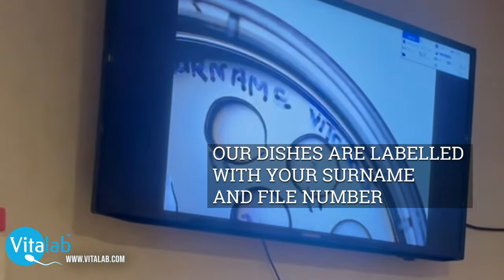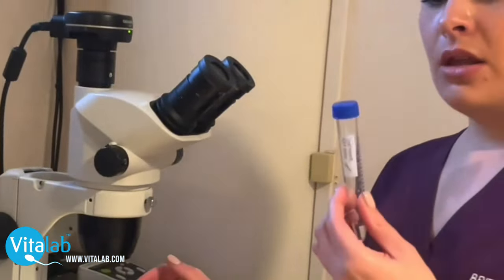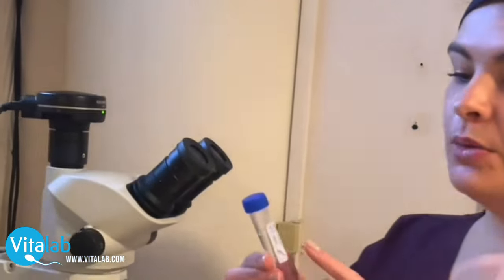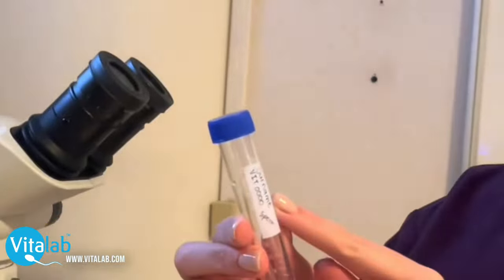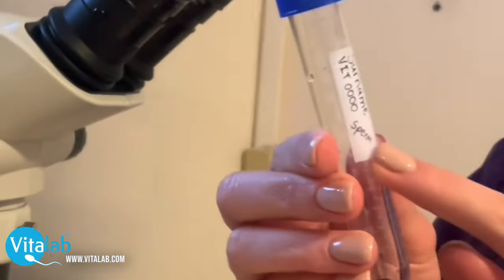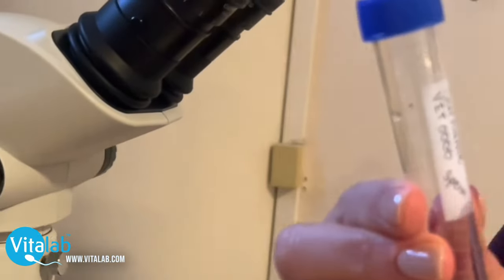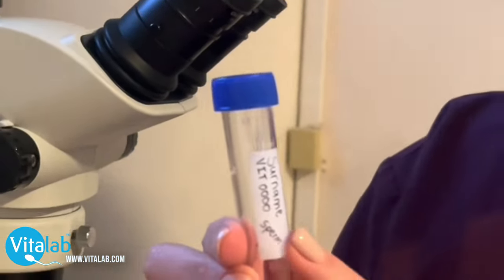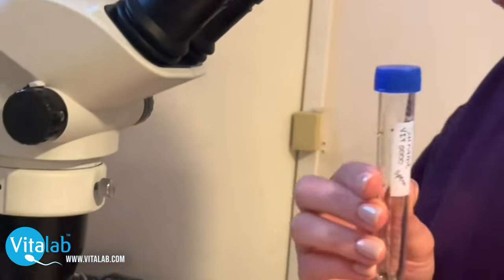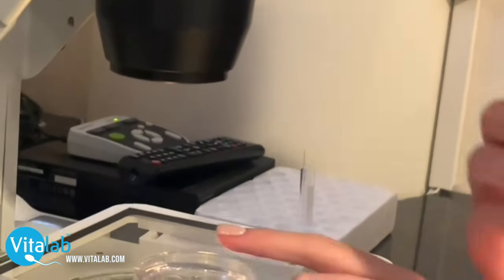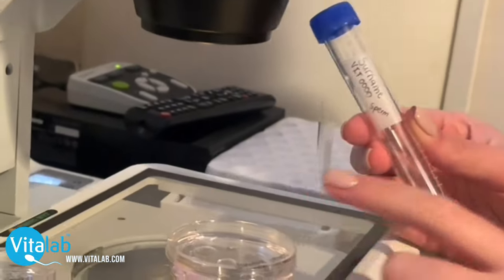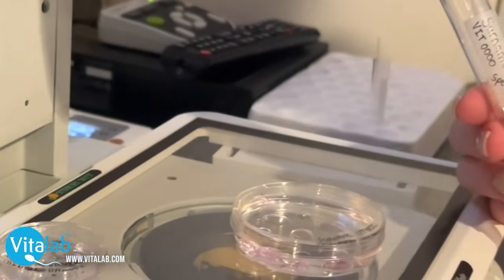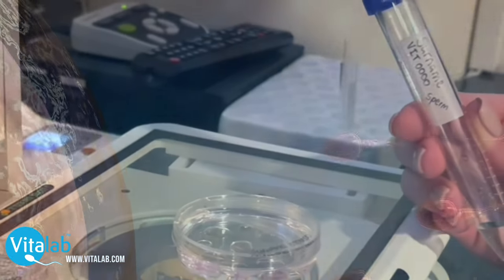We will then perform an insemination. The sperm will be labeled with the male partner's surname and his file number. We will confirm that the surname on the sperm matches the surname on our insemination dish, and then we will use this sperm with these eggs to perform the insemination.